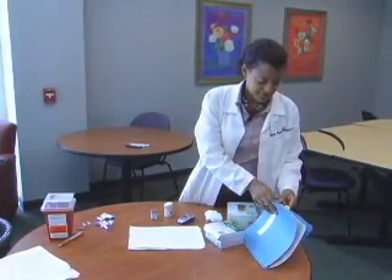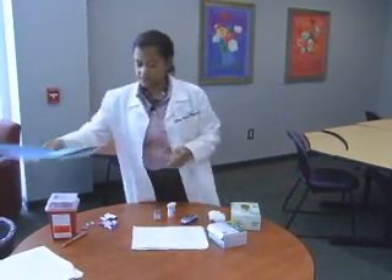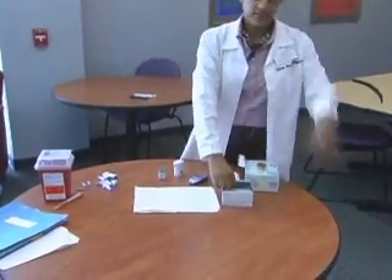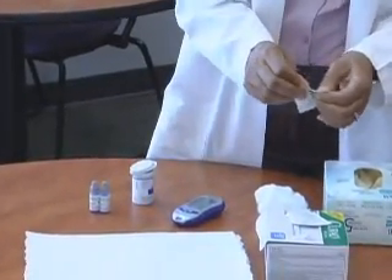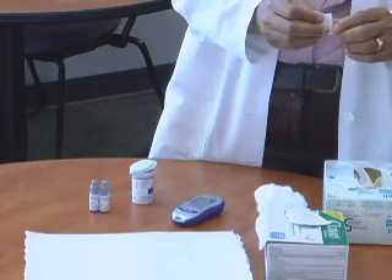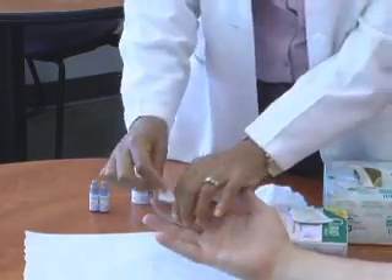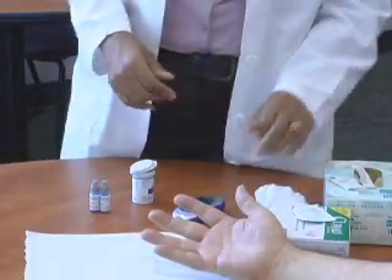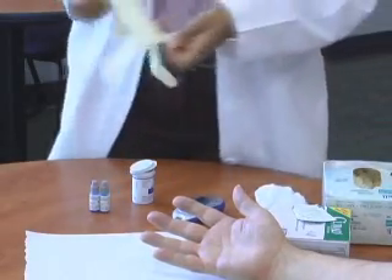The next thing you want to do is have them sit down. I will take an alcohol swab and swab their finger. Go ahead and swab the finger well, and then let it air dry. You never want to prick a finger that's wet with alcohol because it will sting.